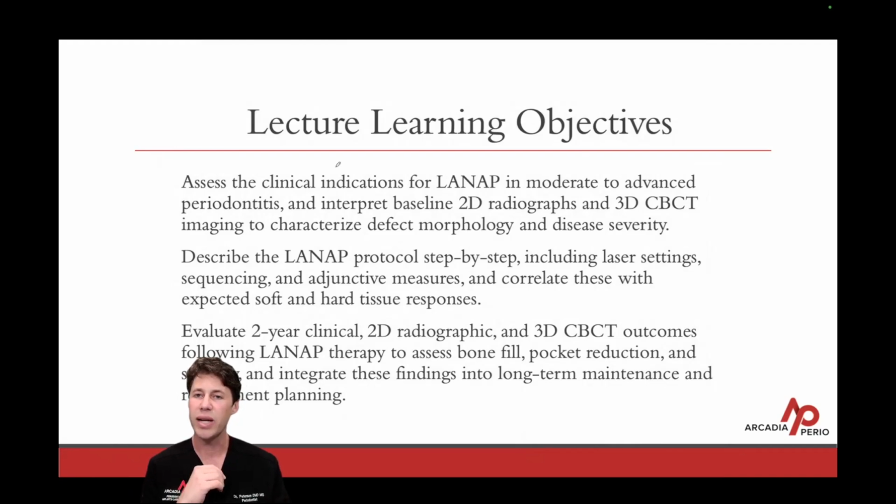And then two, now you're able to evaluate and look at things clinically and radiographically with photos, radiographs, both two-dimensional and three-dimensional, to see how these cases continue to grow bone over time. I hope you learned a little bit more about prognosis and how I view teeth at my office.